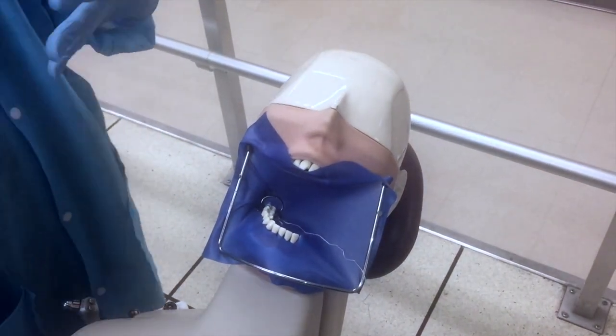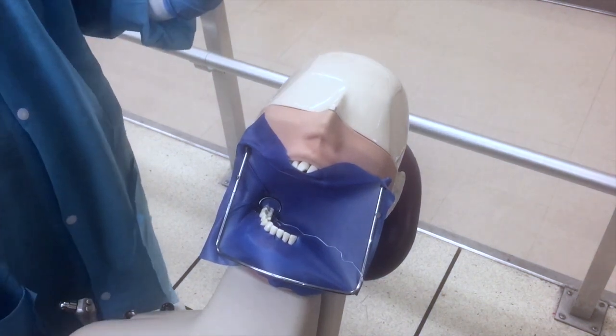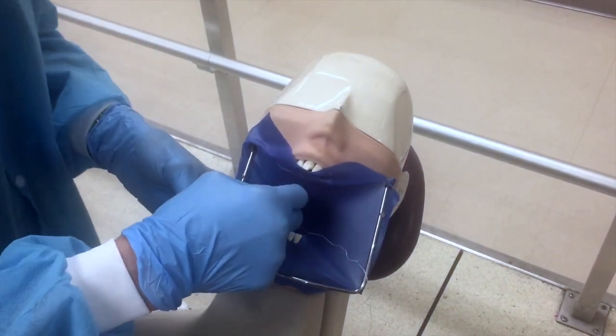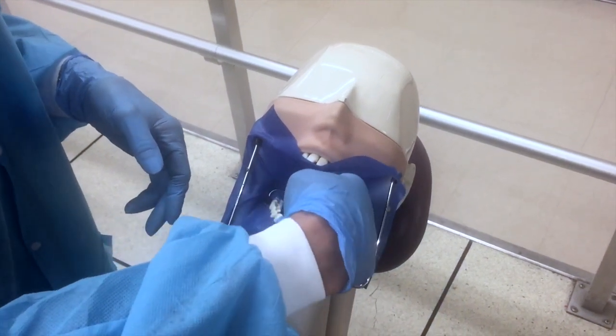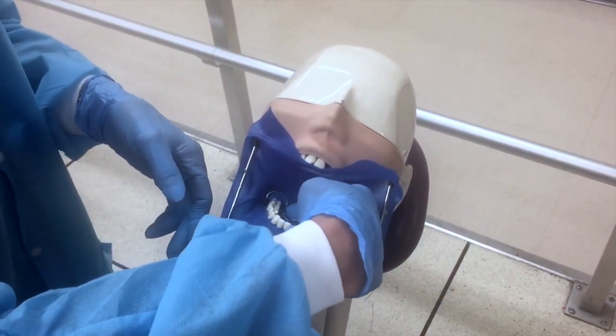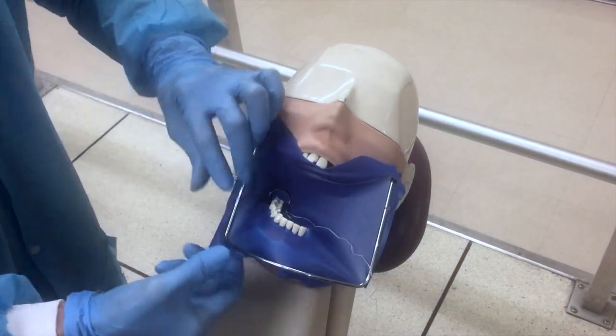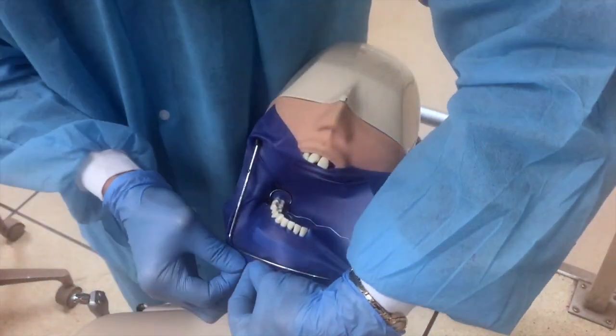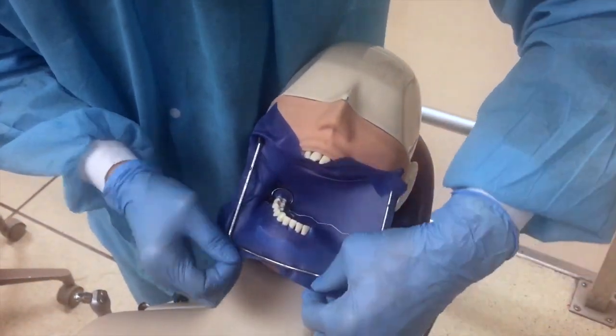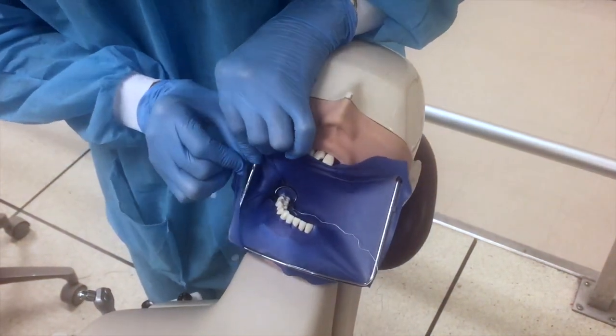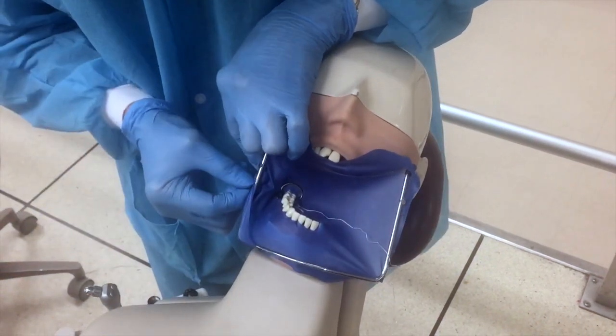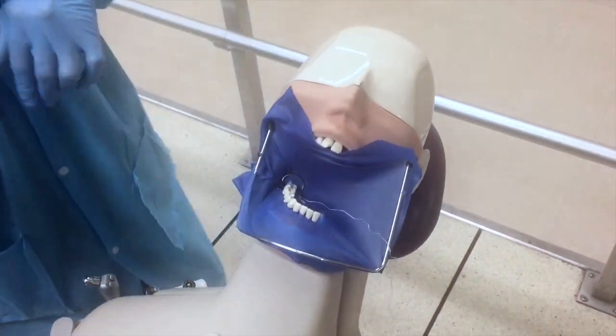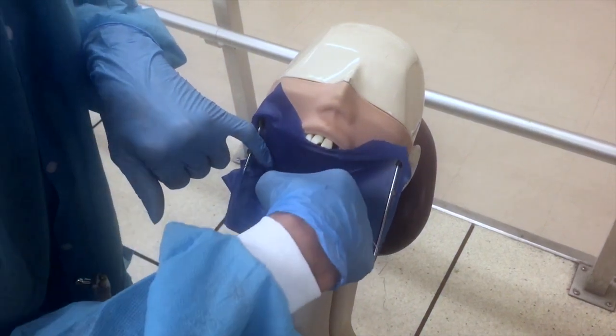Don't worry about that. You can take the saliva ejector and hold it right in there. Sometimes you can make like a little cup here. Water will collect there so it's not dripping all over the place.